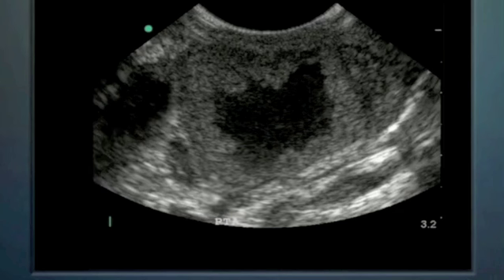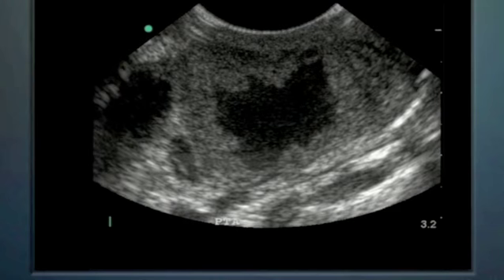This is a very large peritonsillar abscess. We see over here that these are 0.5 centimeter hash marks, so 0.5, 1, 1.5, 2, 2.5, 3, a little bit more gives us 3.2 for the depth. And so this is measuring from this mark all the way down to this, about a 1.5, almost a 2 centimeter in its longest axis diameter peritonsillar abscess. You think about that, it's a very large one here, very prominent.